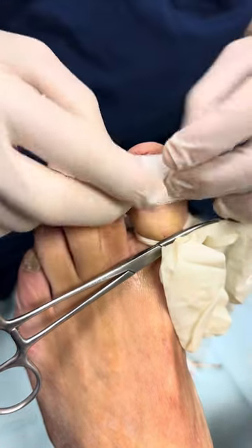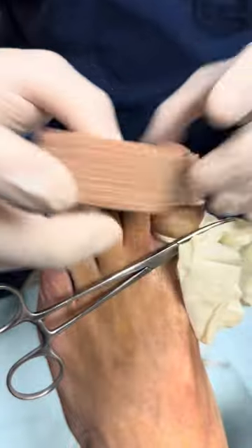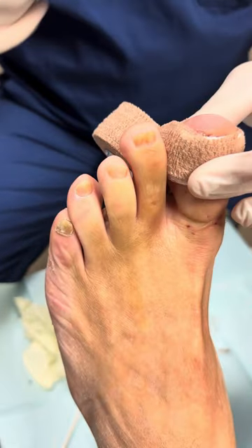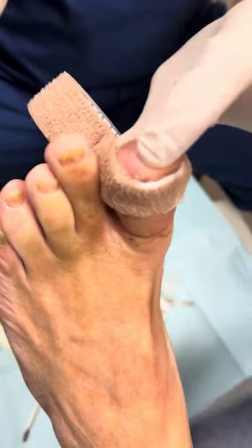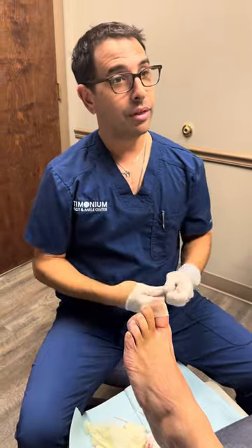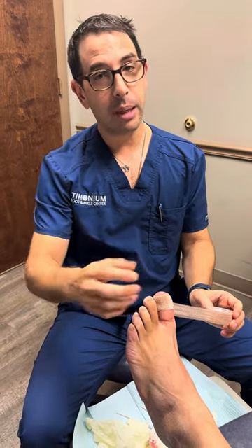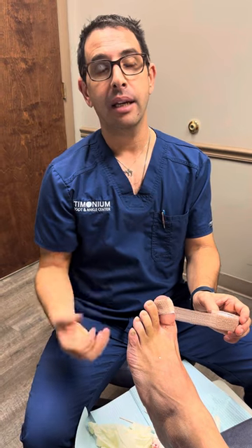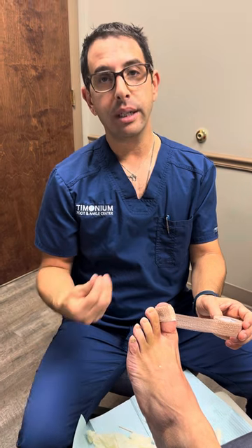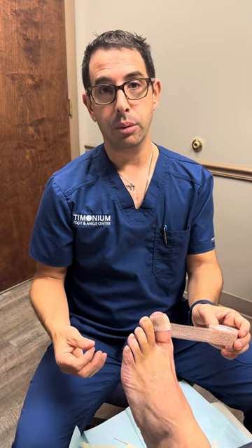I'm going to put a little gel on here and a four-by-four gauze and a little Coban wrap. We're going to let the tourniquet off — it's going to leave a little mark at the base of his toe which will go away. You can already see the circulation is back to the tip of his toe — it's nice and pink. Patients are given a kit to take home with all the supplies, written instructions, an open surgical shoe, and are always encouraged to call us if there's any problem. We'll see him back in two weeks.